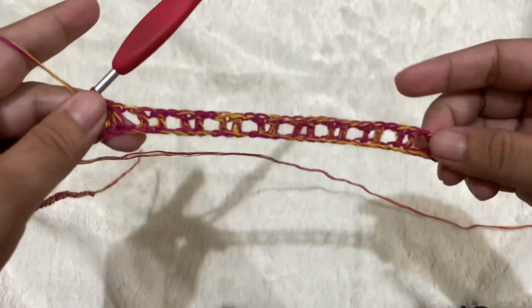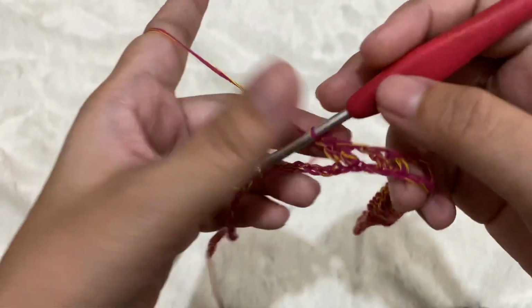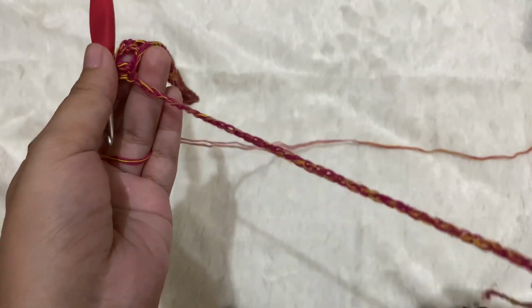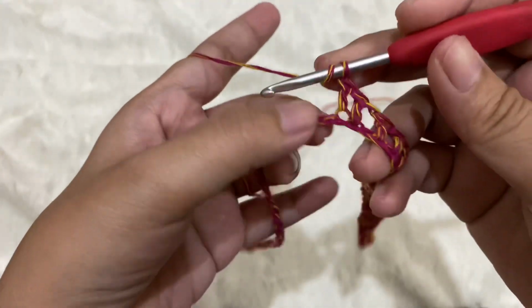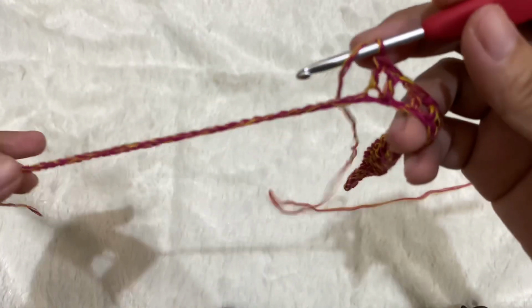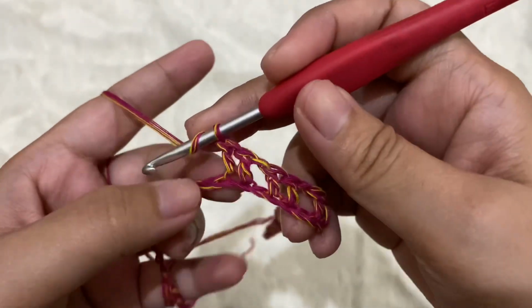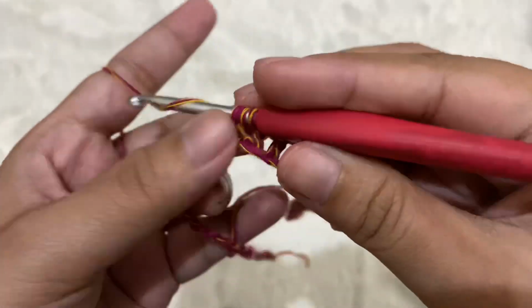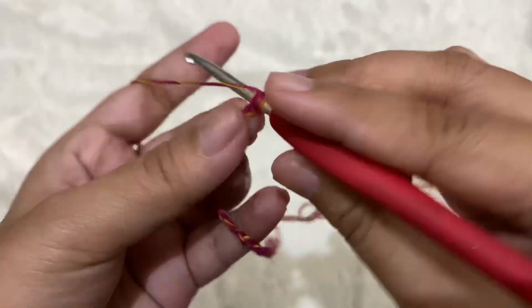So here we already have 10 chain spaces. So next will be just double crochets, okay, all the way to the end of our foundation chain. Okay, so like I said, we don't have a specific number of stitches. I don't even know how many I have left here. Okay, just finish it with double crochets until you reach the end. So double crochet on each stitch of your foundation chain. Okay, so just continue doing that, and let's meet at the end of this row.